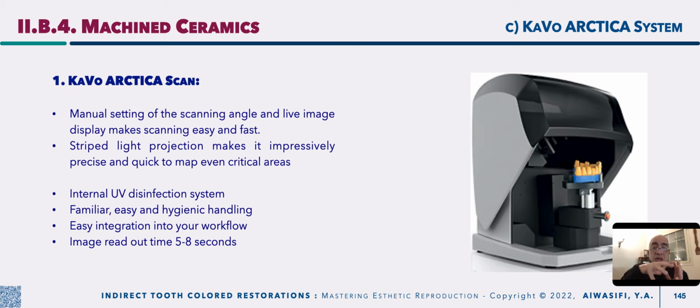What about infection control? Especially as you are using different models constructed from different impressions from different patients. The system has an internal ultraviolet disinfection system. That's why it ensures hygienic handling.